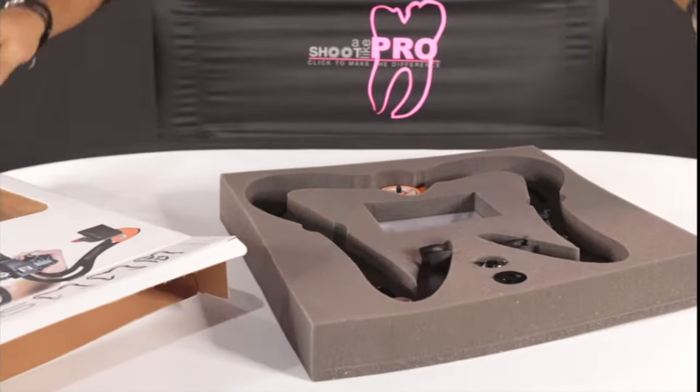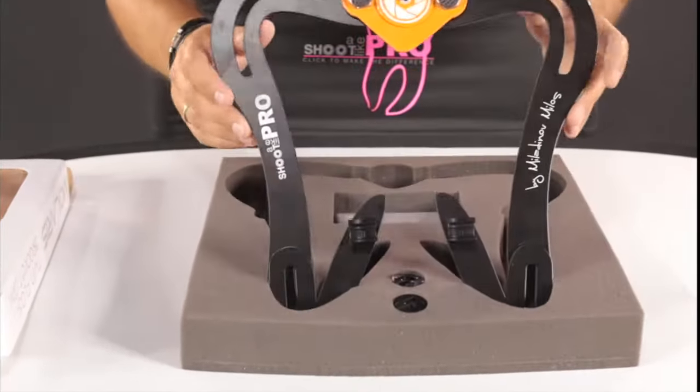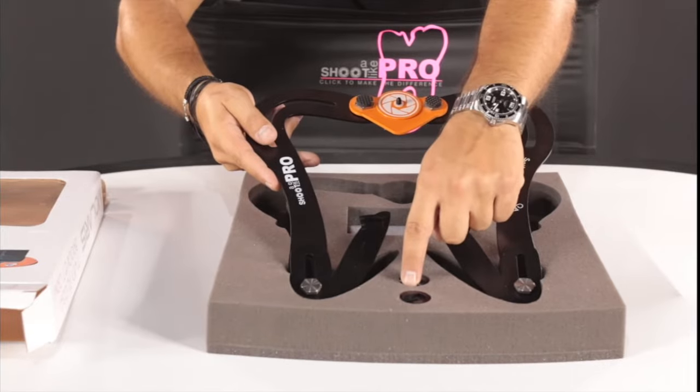So this is what we have. As you can see, this is the new limited edition for 50 pieces only. And we have here the Nikon adapters and these two are for Canon.